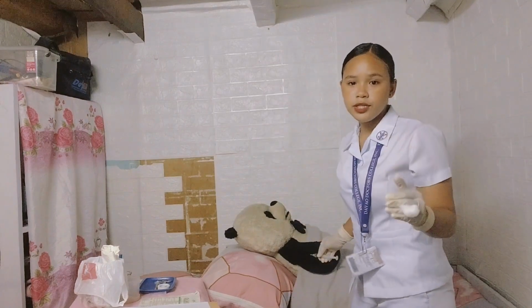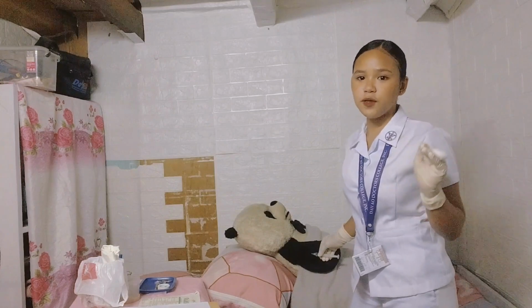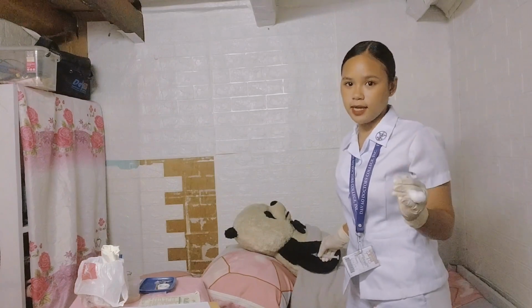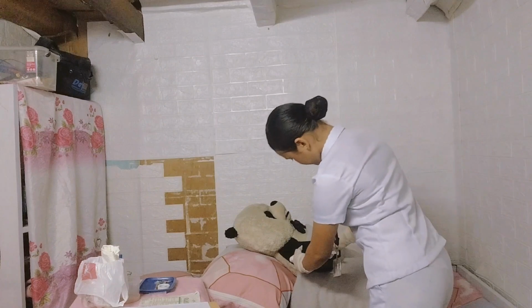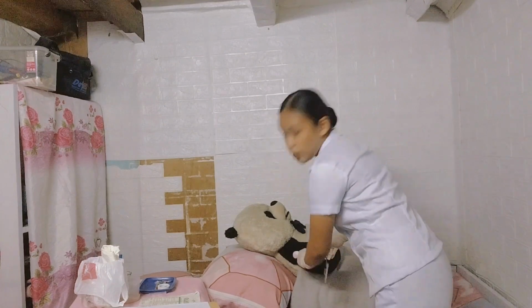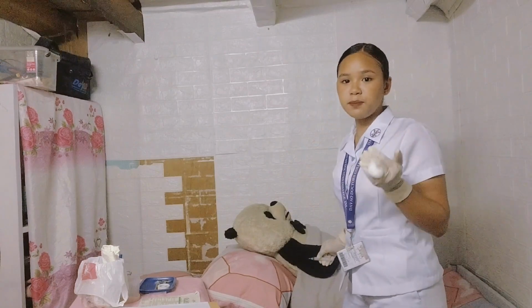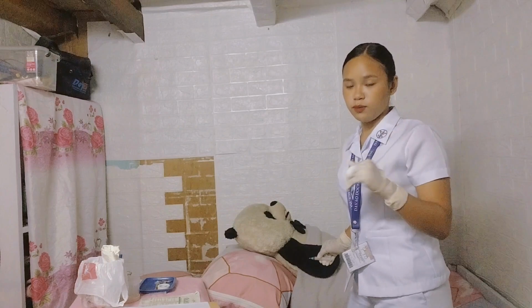Holding the syringe steady minimizes the discomfort, and after injection, wait 10 seconds if using the ventrogluteal site. After withdrawing the needle, apply gentle pressure at the site with a dry cotton ball.